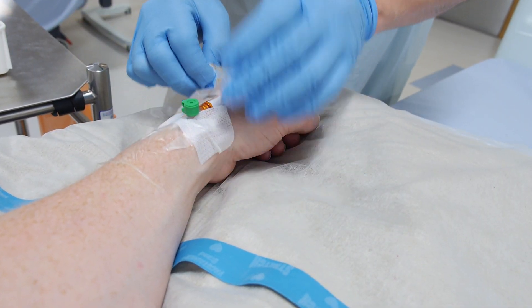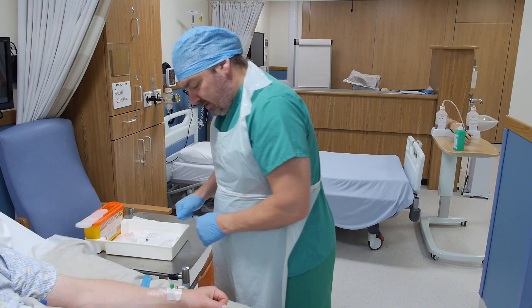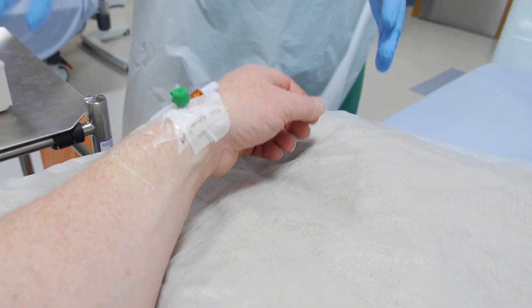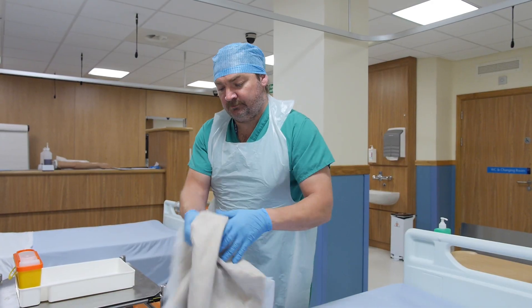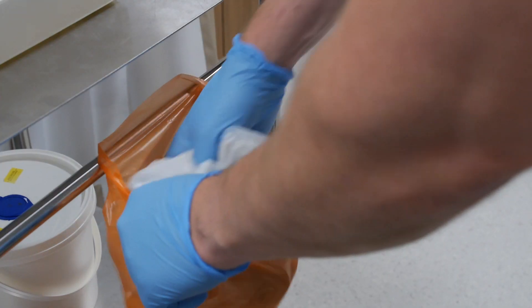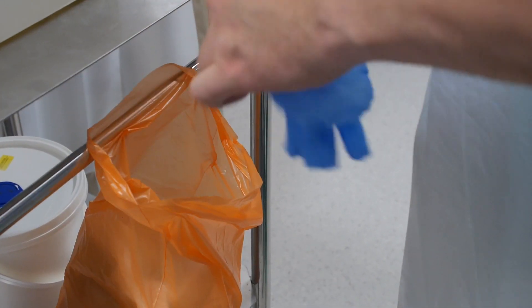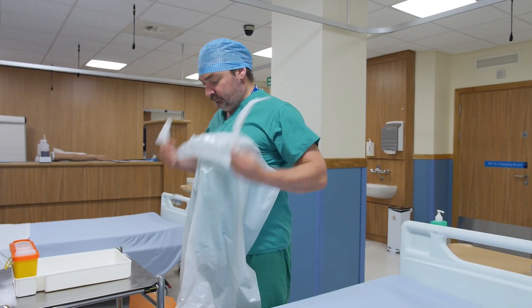It's important to instruct the patient to report any swelling, redness or pain. Dispose of clinical waste and dispose of your PPE — gloves followed by apron.